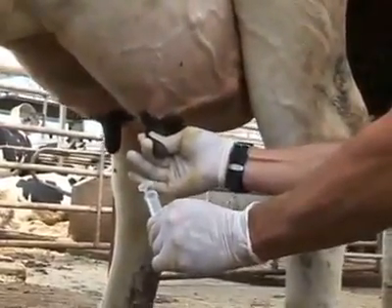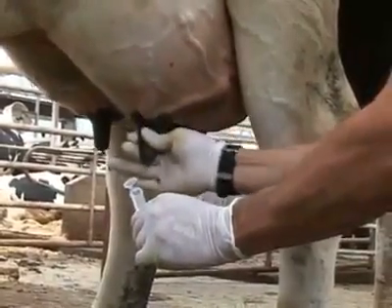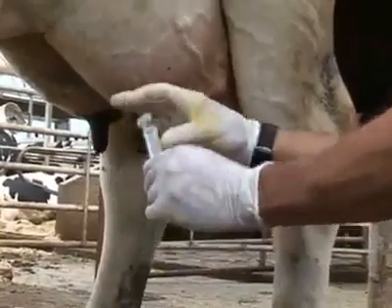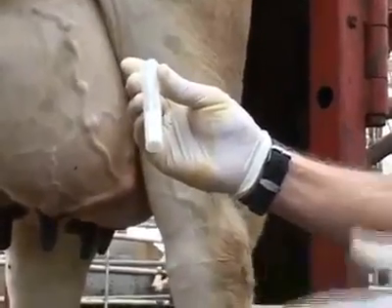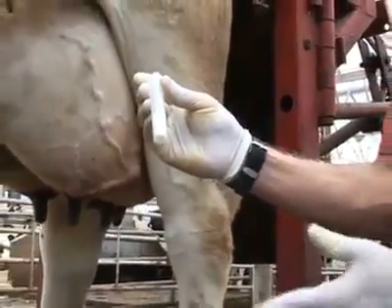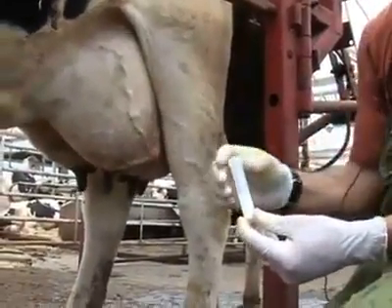Then we fill the tube up with milk, a small sample, at least a quarter of the way up the tube, and then we close the lid and we have our sample vial to turn in for microbiology. Whatever organism grows should be the organism that's actually causing infection in the gland, causing mastitis.